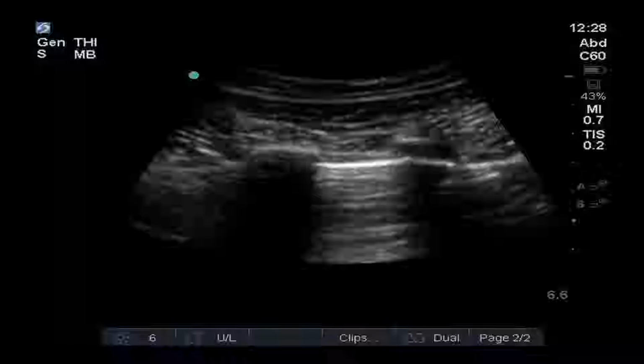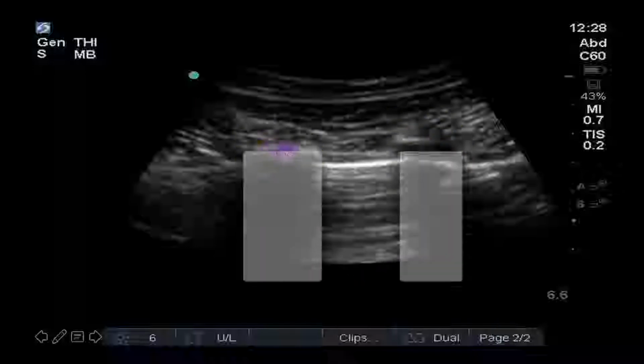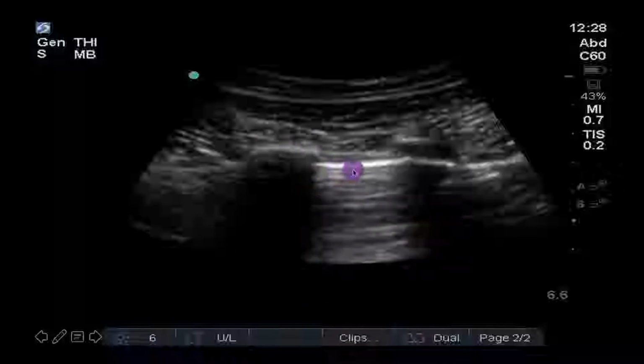This is the basic lung ultrasound view. We initially see subcutaneous tissues. A little deeper, we have different white lines. There are these two mildly higher lines that represent the ribs. We can know they are the ribs by the characteristic shadowing deep to them. The white line between them and just deep to them is the pleura. The culmination of all of this is termed the bat sign.